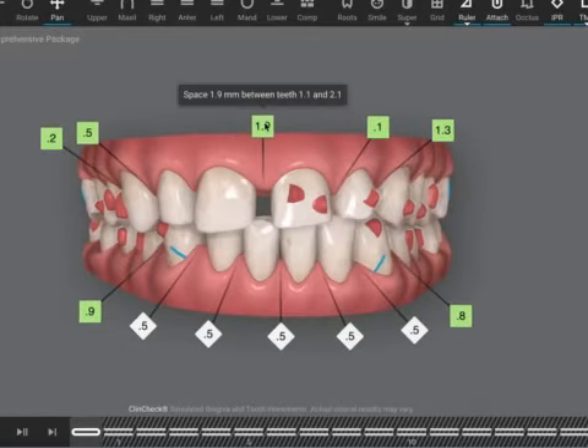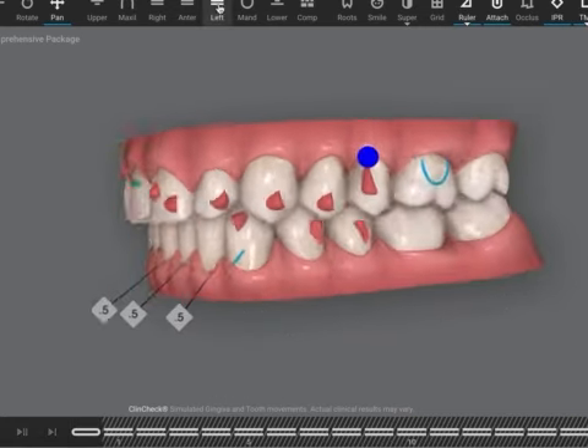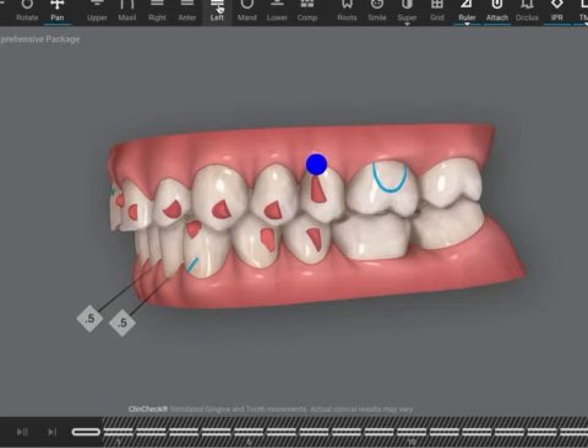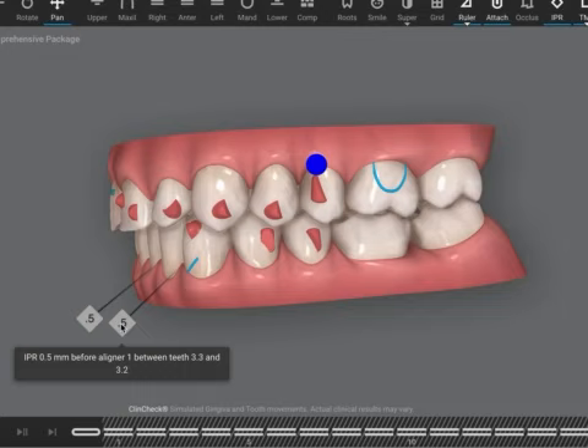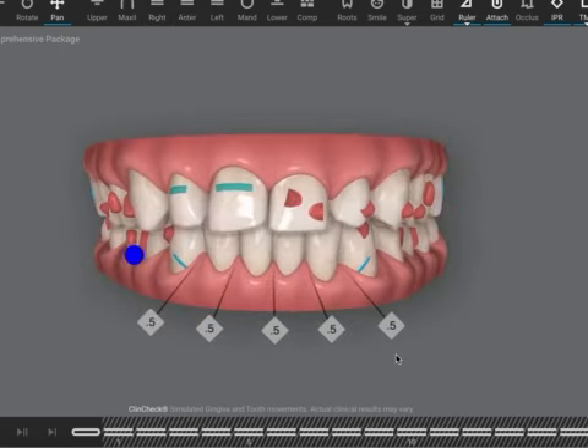It is a very big space here. If you're wanting to close space, the check is already showing you the overjet is going to increase — nothing wrong with that, that's fine. I would have probably done less IPR because if it's showing you this overjet, you might as well reduce the IPR. I don't think you need this much.